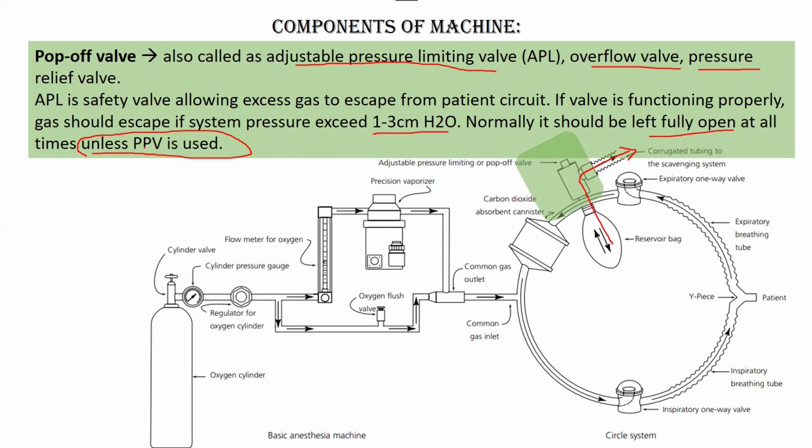That is when positive pressure ventilation is used, but I am not going into the detail of PPVs because if I get into the detail of this, you guys will get confused. And as far as simple exams like BCSE are concerned, you need not dig deep into these things, because once you are practically using this anesthetic machine, you will see and understand this.